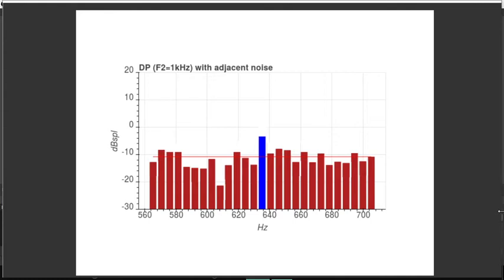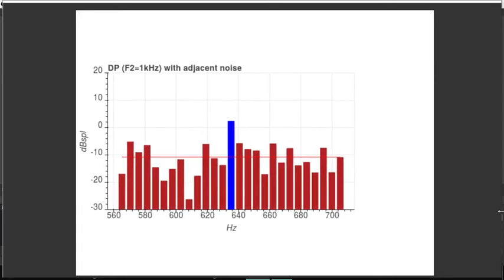So that kind of thing that I'm doing with my eyes to see whether it looks safe or not, we can do statistically. The way we do that is to look at the height of each of those noise values and look at the statistical distribution of it. When we do that, we find that the noise values are typically distributed in a normal or Gaussian distribution.